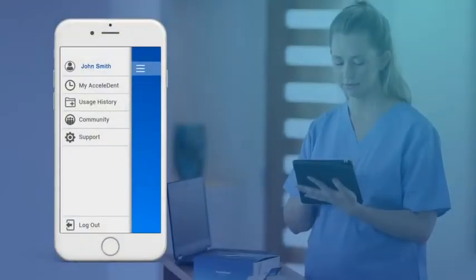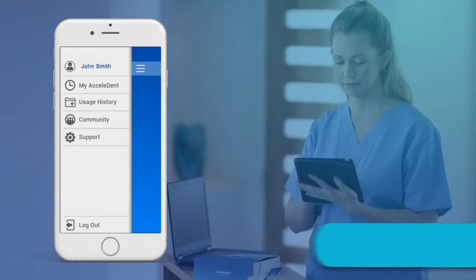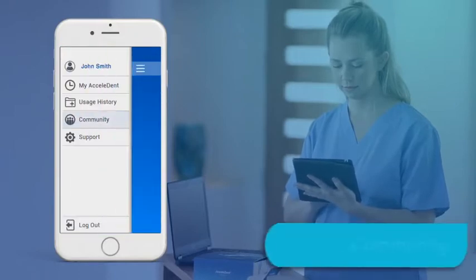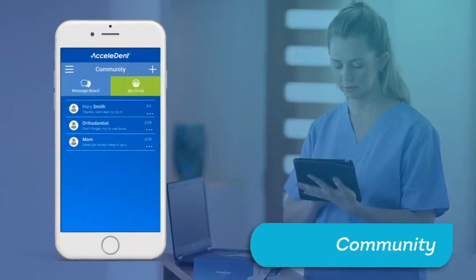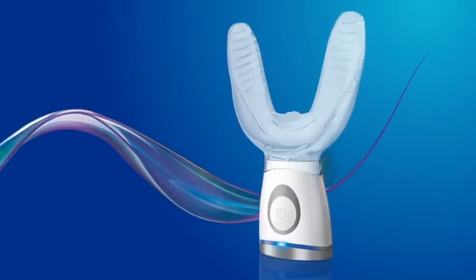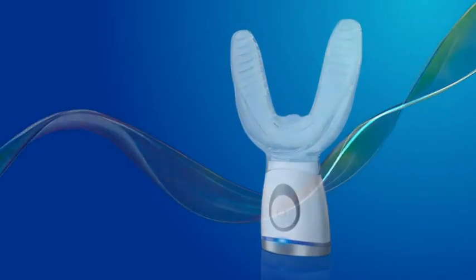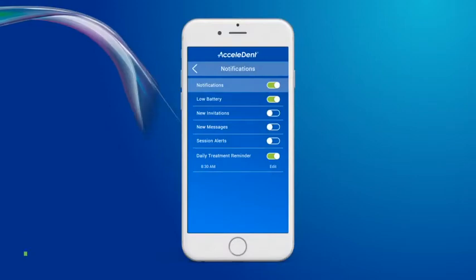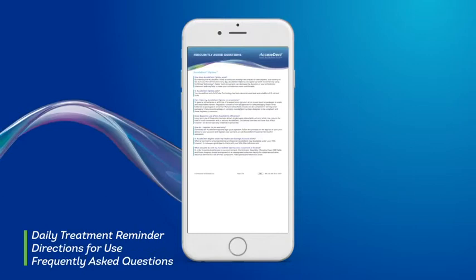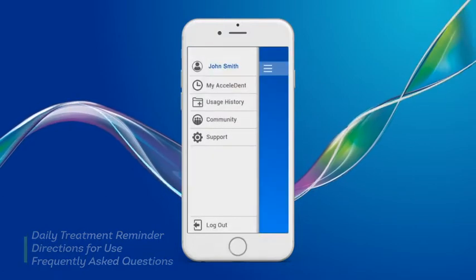Observers can see the dashboard reports of an Accelident user by tapping on Usage History and choosing the patient's name. Words of encouragement can be sent by tapping on the Community tab. Explore the Accelident app for many great features to help improve your accelerated treatment. Find links to notifications for the daily treatment reminder, directions for use, and frequently asked questions under the Support tab in your main menu.